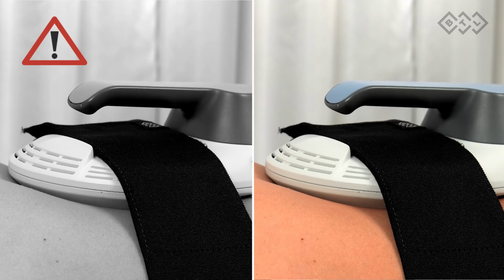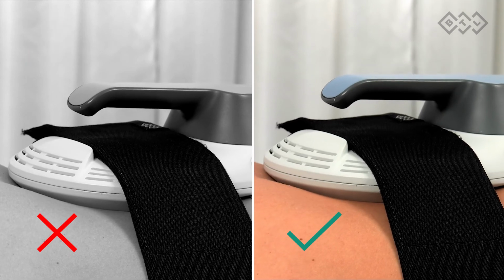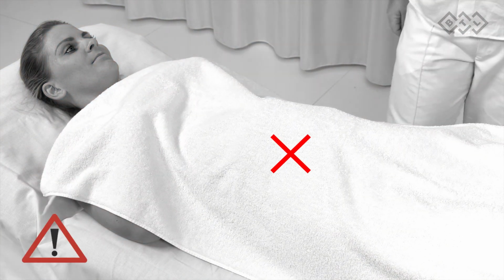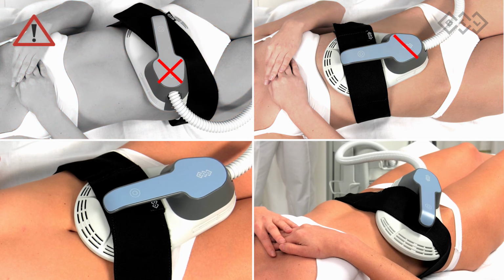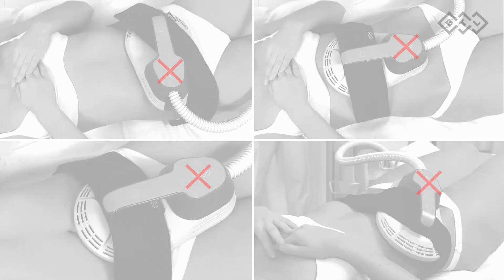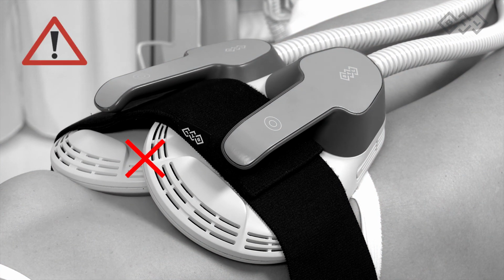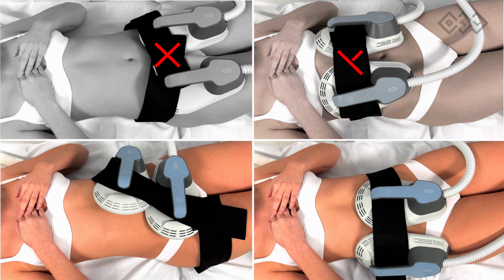Always use a treatment intensity just below the patient's tolerance threshold to ensure the strongest muscle contractions. The applicator must never be covered. This may compromise the cooling process. The applicator is positioned incorrectly. The applicators must never overlap each other. The applicators are positioned incorrectly.